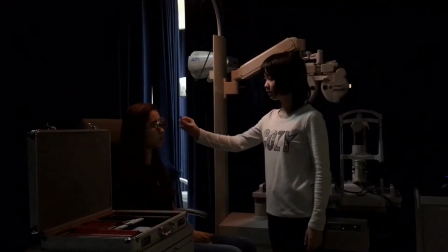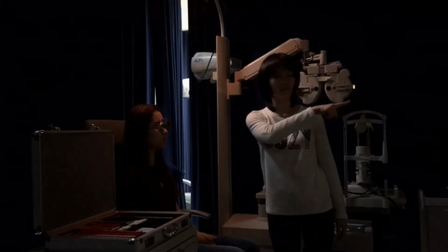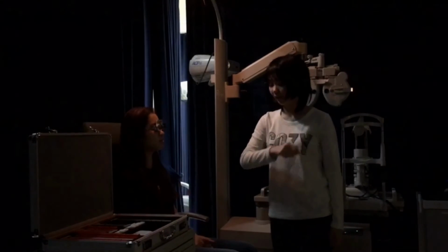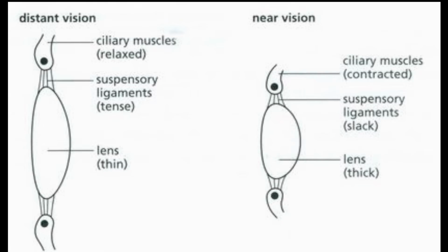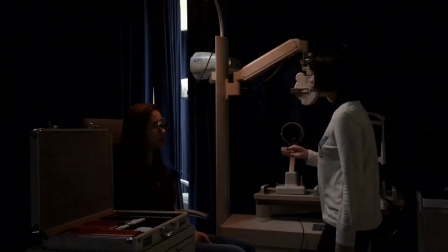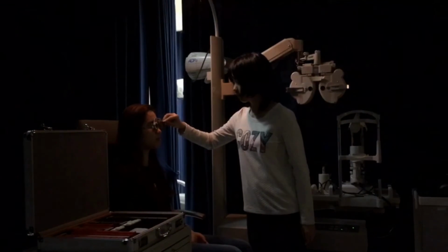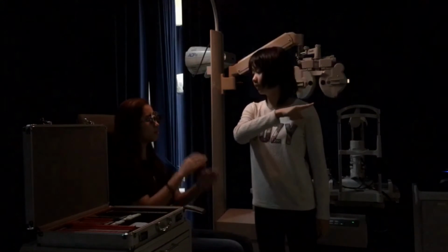The incorrect preparation method is fogging too much or too little. When the patient's eye is not fogged or fogged too little, the target can still be seen clearly. This encourages accommodation, which affects the results of the retinoscopy. Fogging too much is also incorrect because if vision is overly blurred, the patient might instinctively accommodate to see clearly.